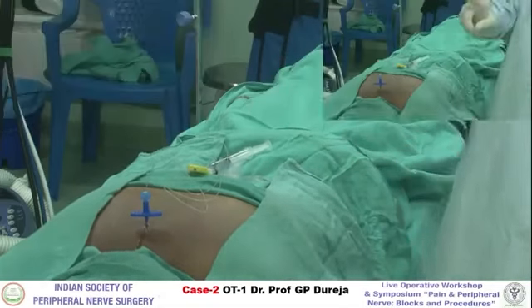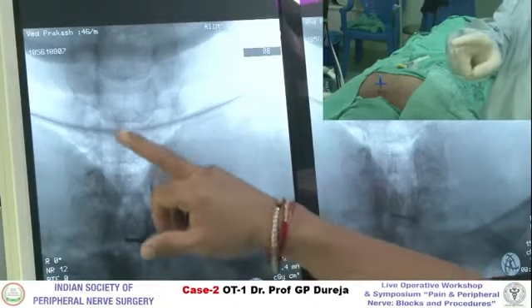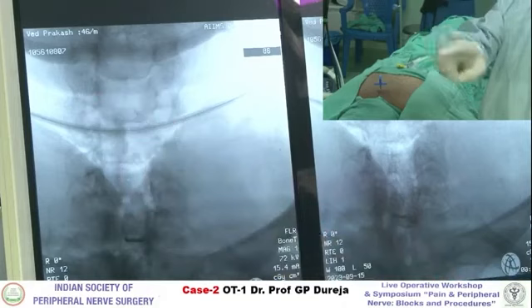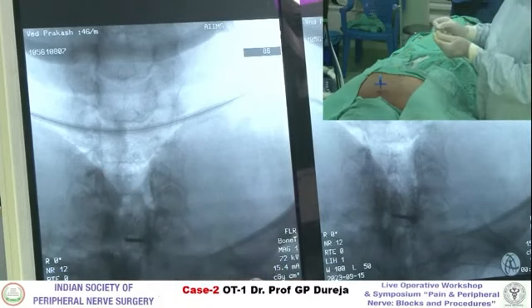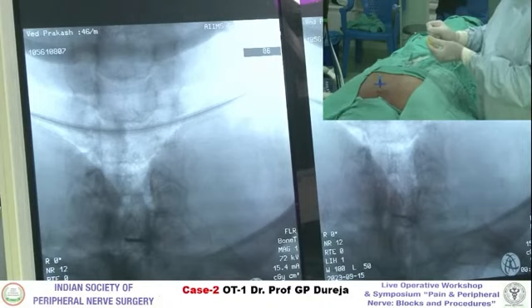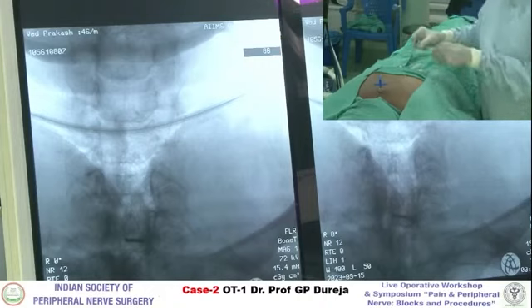Can someone point the nerve root at C? Not there, left side. Yes, from here, now the whole thing, yeah, these are the roots. Come down, come down. This is the root. So that's why we abandoned cervical root sleeve block. We rely only on the epidural, safe and effective.